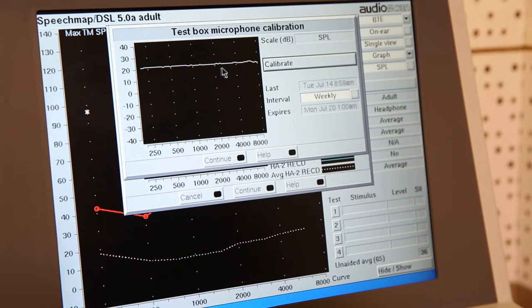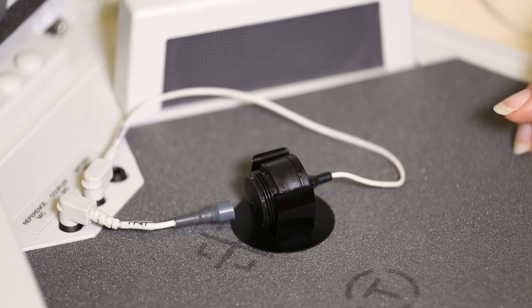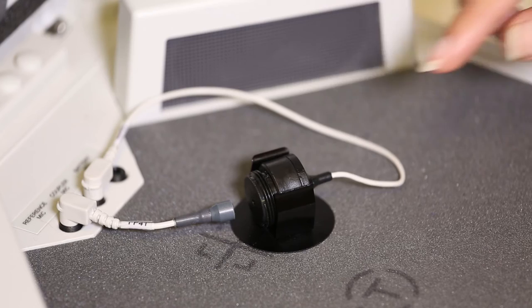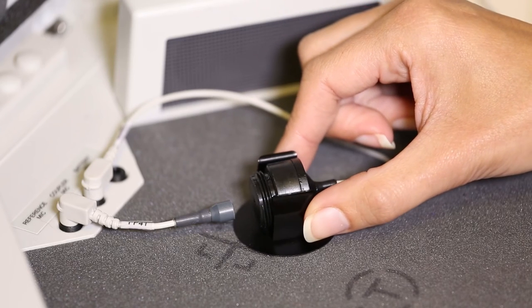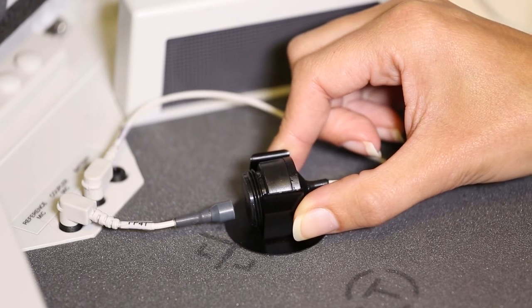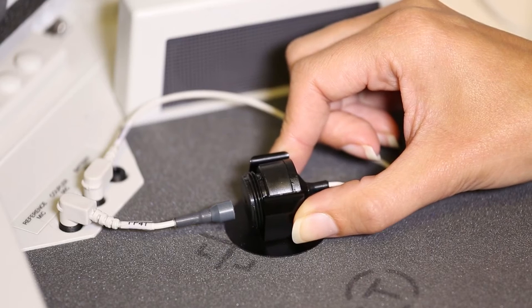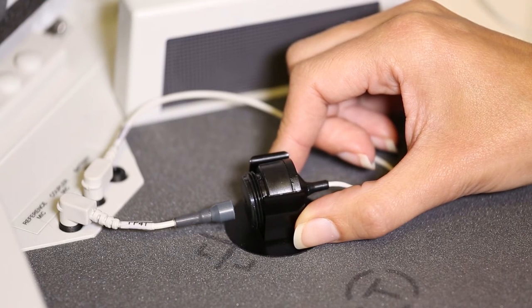We are looking to ensure that this line is as straight as possible. If the line shows some distortion, it is likely that the microphones are not close enough or are at an angle. You can then rearrange them and retest until you get a straight line.